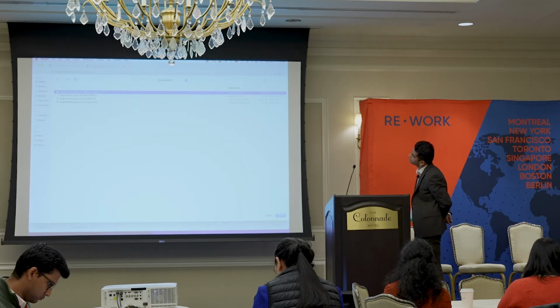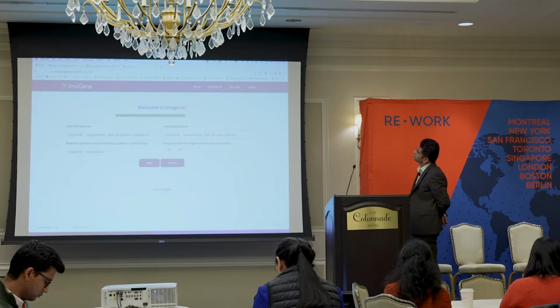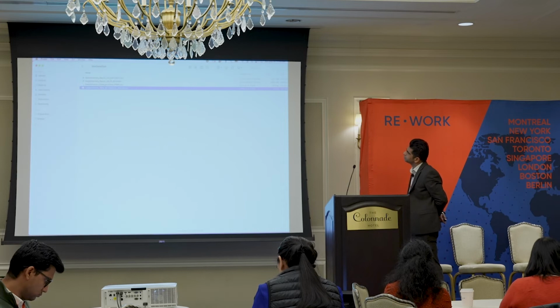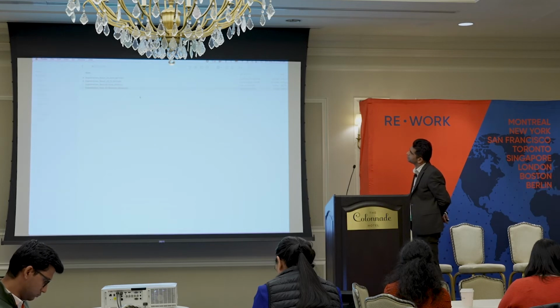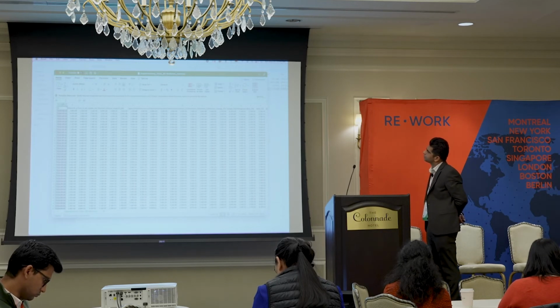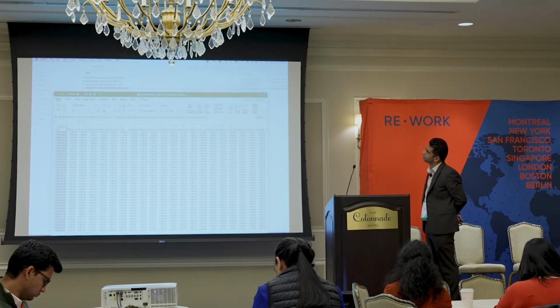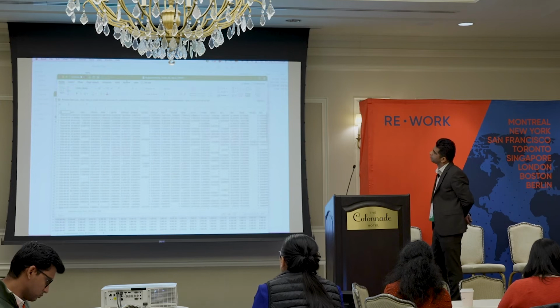Here we would select, since we indicated data type as imaging, radiomic.csv as data and genefpkm.csv as our genomic feature file. Just to allude to how these files look, these are essentially comma separated values that could be opened up in Excel or prepped in Excel and stored as .csv, where they have a common ID column between both the radiomic and the genomic or any other omic data file that you want to use.